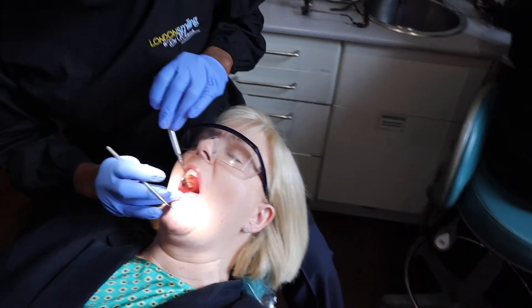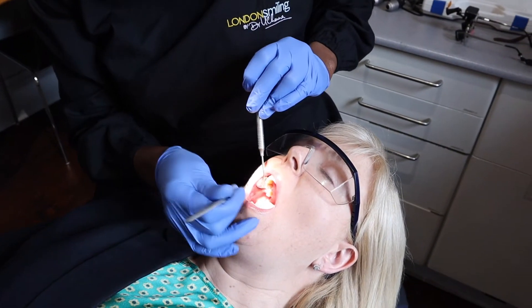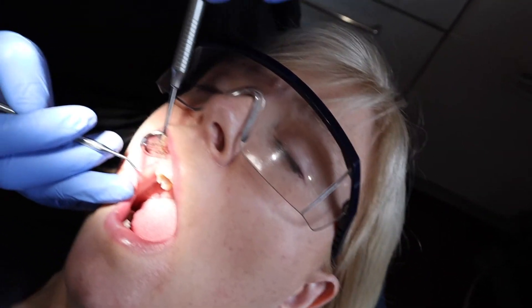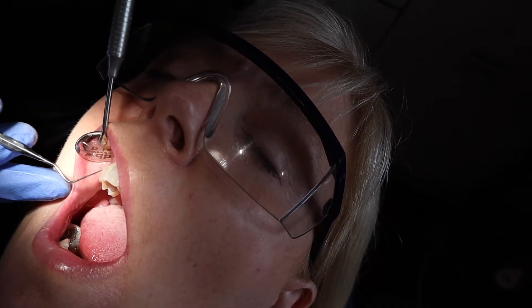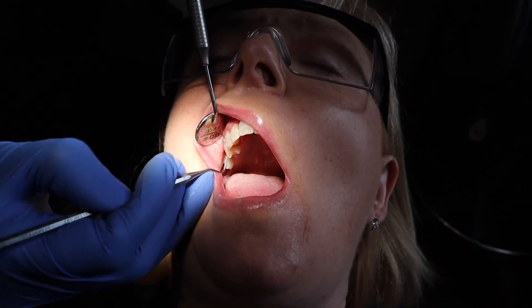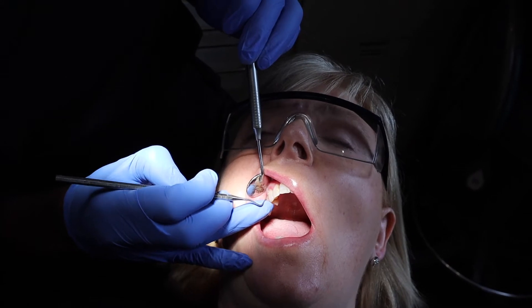What happens next now is I'm going to be looking at gums first. This little ruler is called a perioprobe, and what I'm doing with it is just pushing it into the gums. I can see that Deirdre's gums are inflamed. I don't know if you can see this redness — there's like a red rim around the gum as opposed to pink. So already I know, and if I rub here, even though she's brushed really well, there's all this plaque. We need to run through brushing technique because the brush is probably stopping here and it's not getting under the gum enough. If I get the bit of the brush under the gum, the gums will start bleeding.